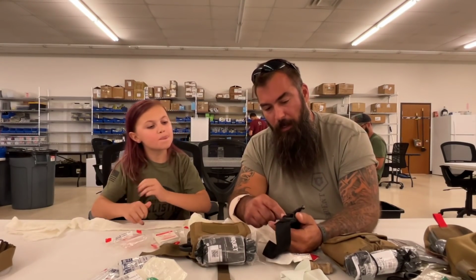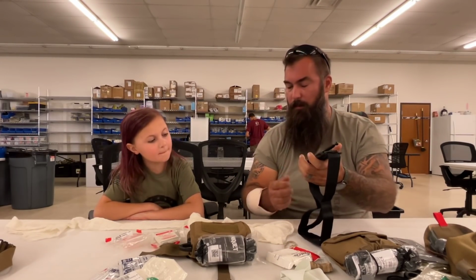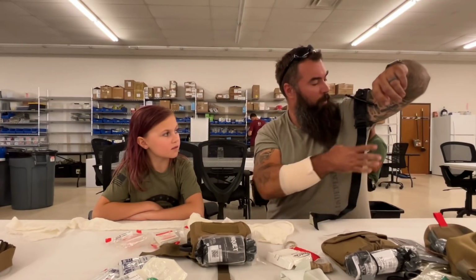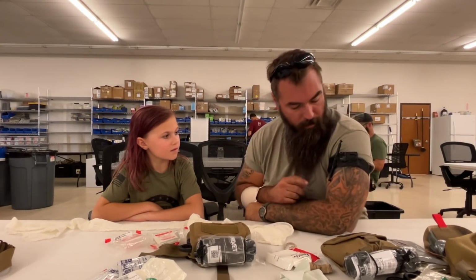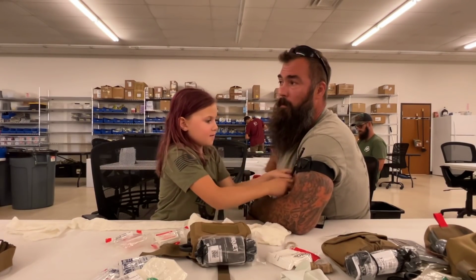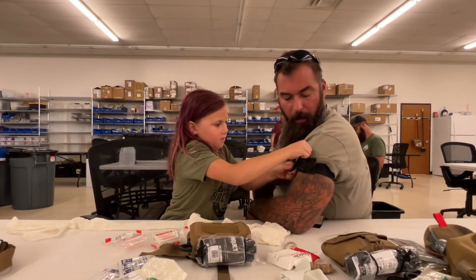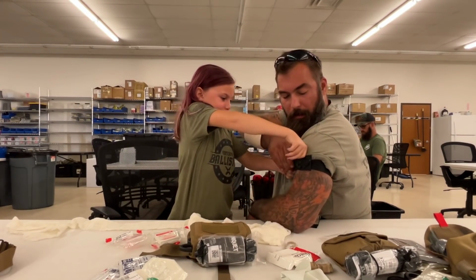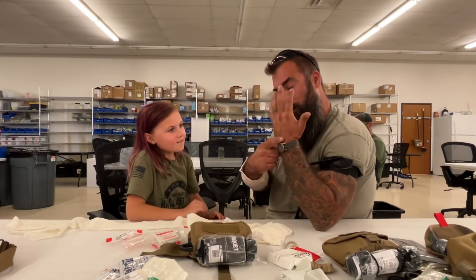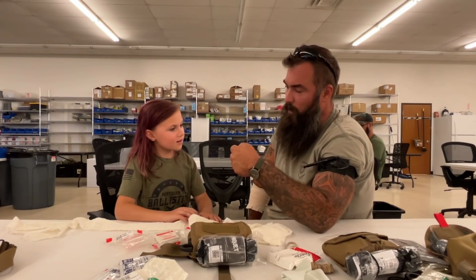Mm-hmm. And when you twist this up, it constricts this band in here, tightens it down, and makes the blood flow stop. Yeah. So you put these on high and tight, right? This one you have to ratchet down. So get it up there like that, and then you need to turn that. And don't be afraid to hurt me. Keep going. One more. Okay. And then that stick goes in there. Oh, I gotta stand up. Yep, you can get it. There you go. Boom. Look, already see the veins standing out in the back of my hand? That means you've constricted the flow of blood to my hand. So good job, fist bump.